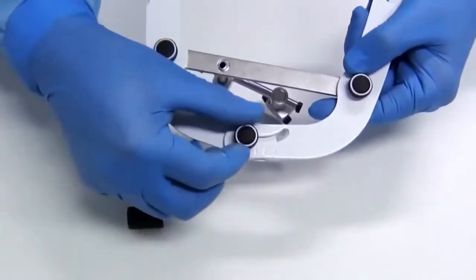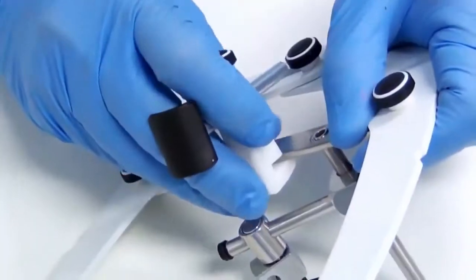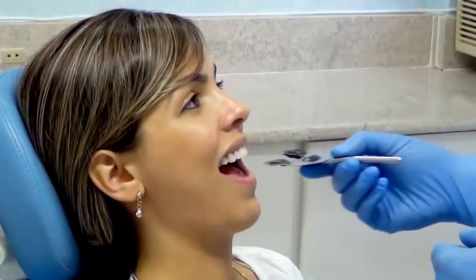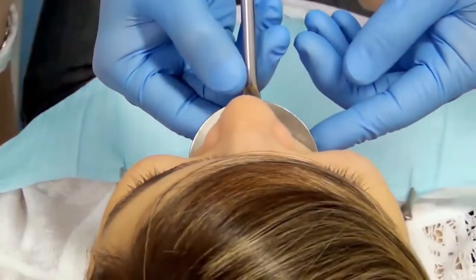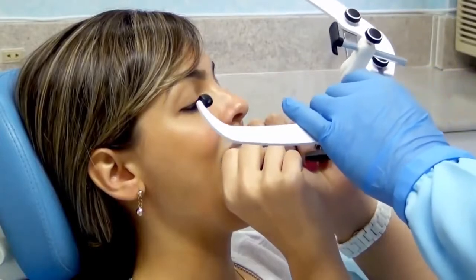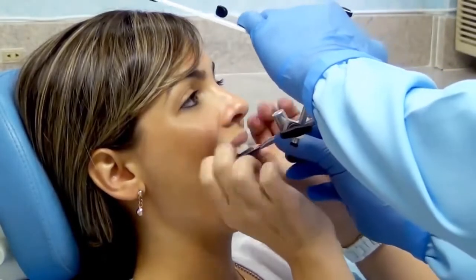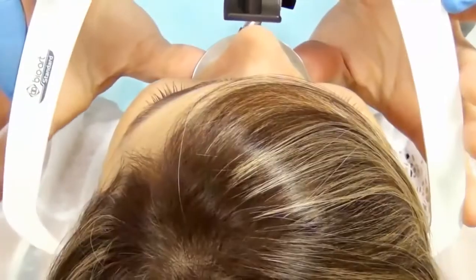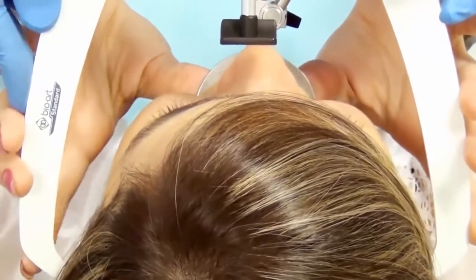Loosen the screws of the face bow and place the nasion relator into the crossbar. Place the fork with the registration back into the patient and ask him to keep it in the same position, supporting your thumbs towards the maxilla. Place the face bow, inserting the fixation set in the bite fork rod and adjust the ear pieces in the patient's external auditory canal.